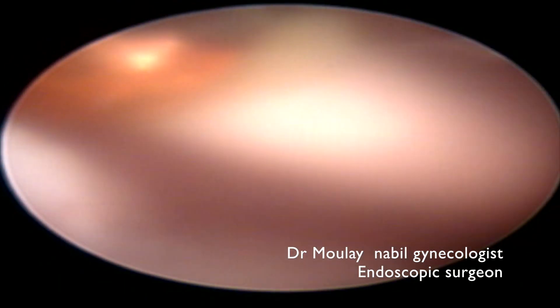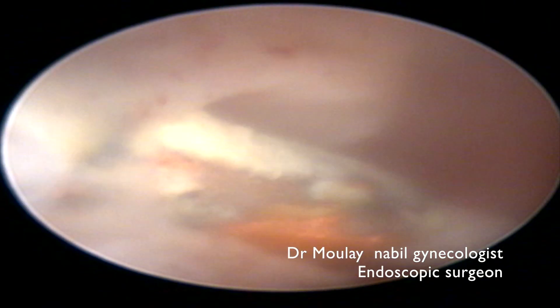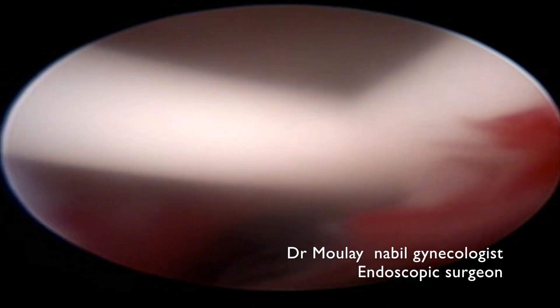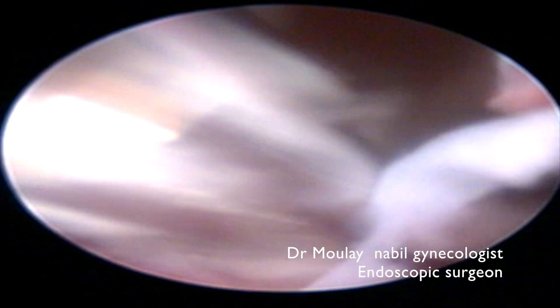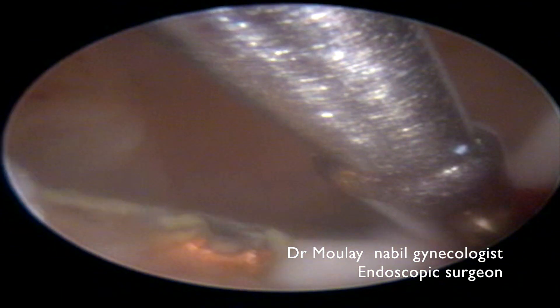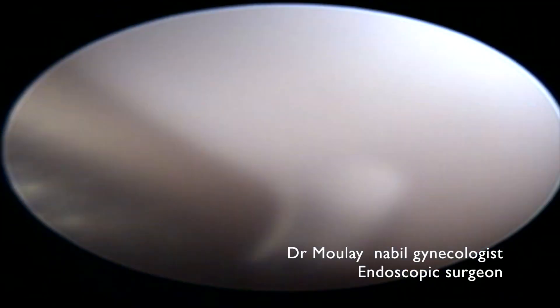We can see clearly the IUD inside the uterus. We push the grasper into the operative sheath, take the IUD with the grasper, and slowly track the IUD outside the uterine cavity and the cervix.